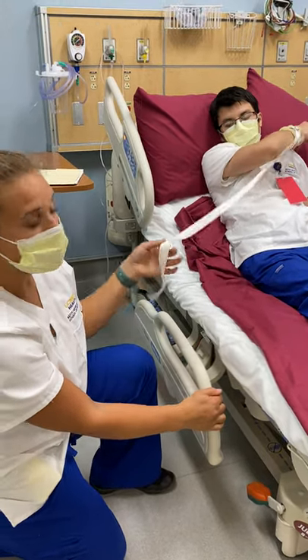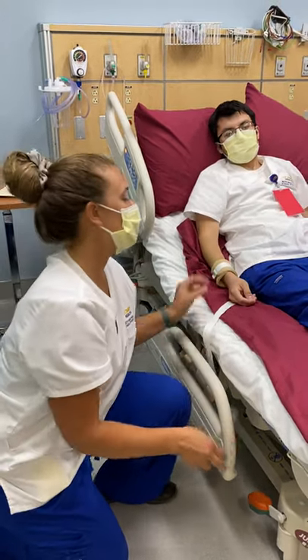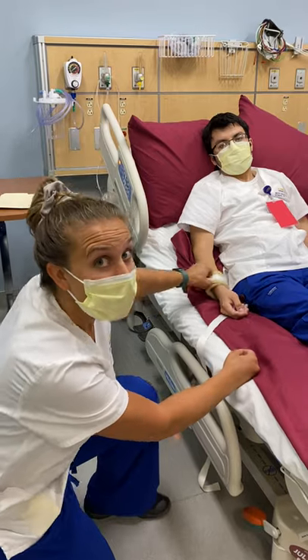You can move it, and so it's not actually locked. That's just the basic gist, and we'll go into it more in another video.